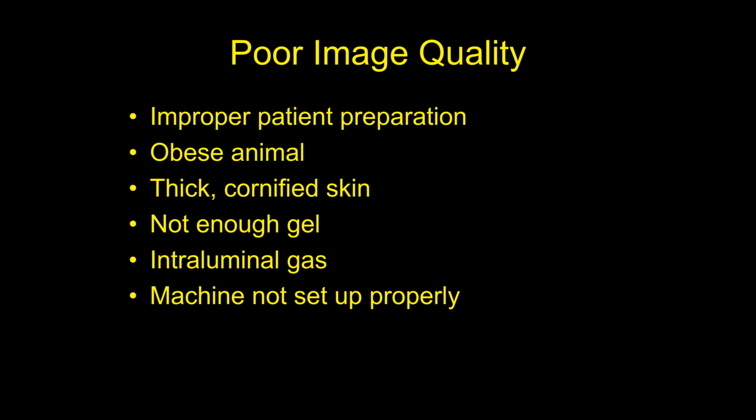You can also use water. You can use alcohol to put on there too. Problem with those, they evaporate really quickly and you're constantly putting more on there. So the ultrasound gel works out a lot better. And so take the time to prepare the animal, clip the hair, use the lube, use the gel, all that kind of stuff, and it'll make your picture a lot prettier.